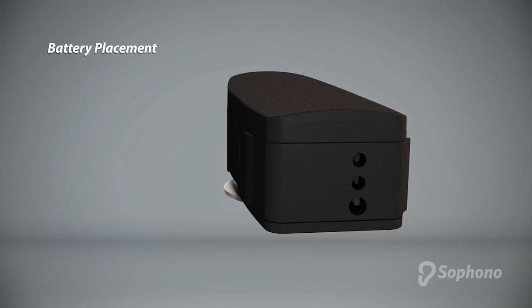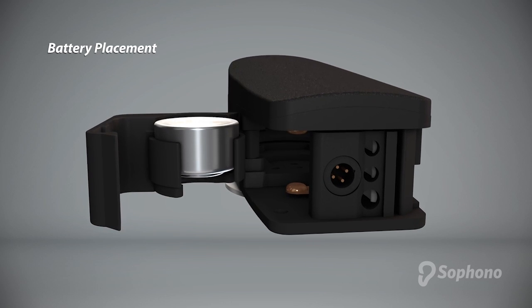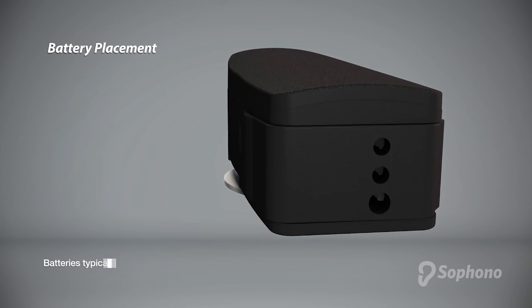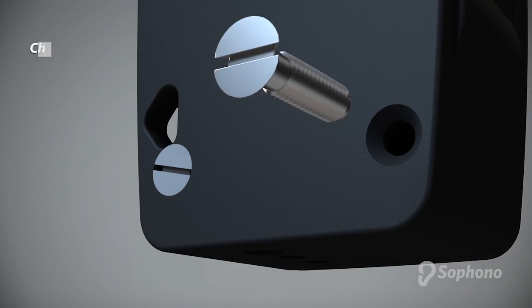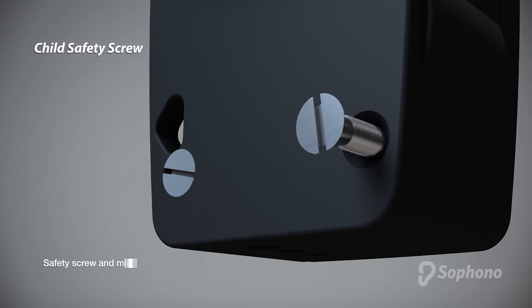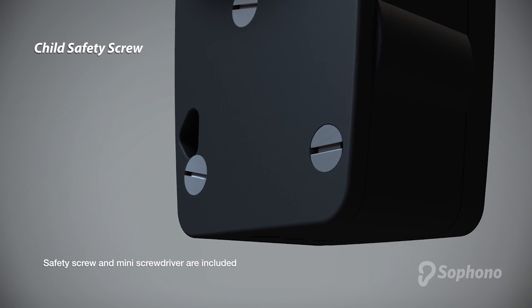Insert a new size 13 battery by opening the door and placing it firmly in with the plus sign facing up. Then close the door. Batteries typically last two weeks with normal use. You may optionally insert the child safety screw to secure the battery compartment in order to prevent young children from gaining access to the battery.